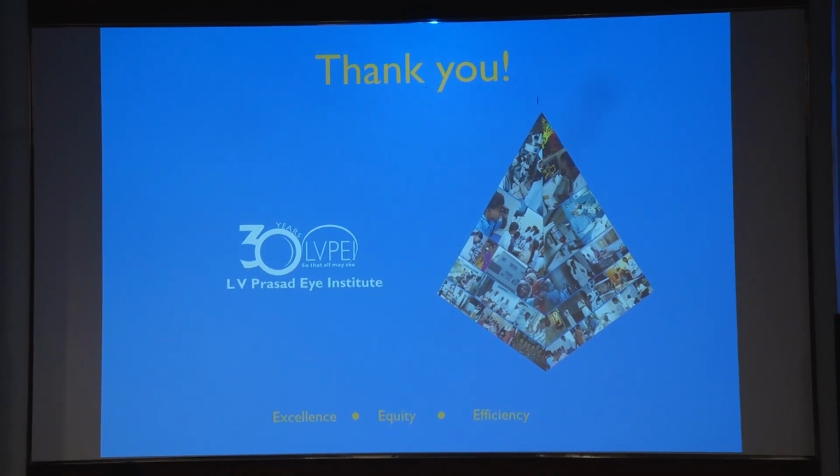Since our second speaker could not come because of personal reasons, I would talk about Kahook dual blade surgery also. Developed by New World Medical, Kahook dual blade is an instrument which has a sharper tip, a ramp, and a dual blade. It is used for MIGS procedures to do a trabecular meshwork cleavage procedure.